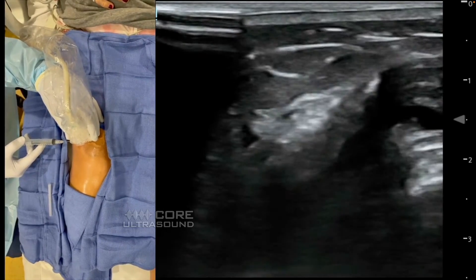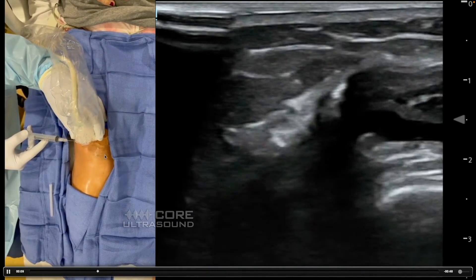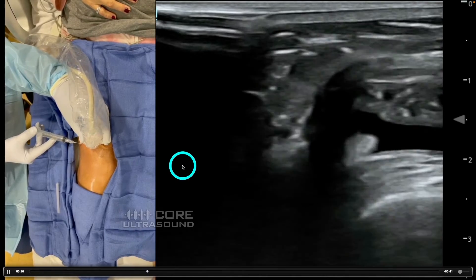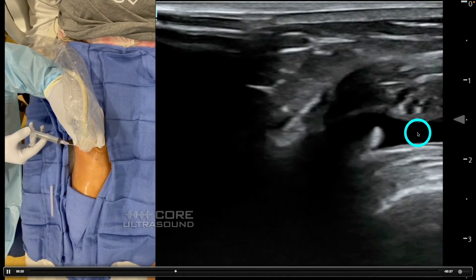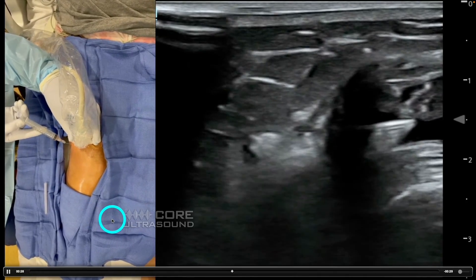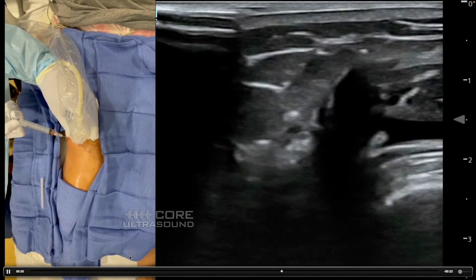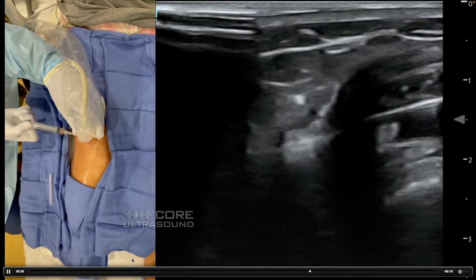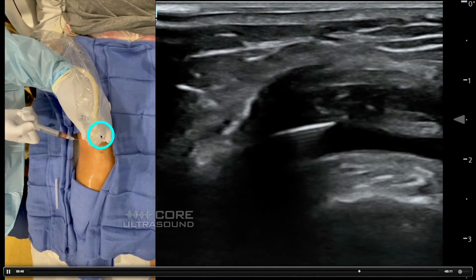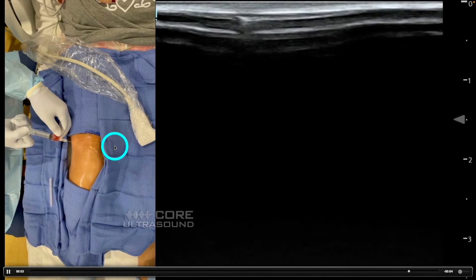Here is an example of performing this technique in the long axis of the transducer. I'm using a very small intradermal needle here, and you can see I went a little too inferiorly, so I'm having to angle it up a bit to get to that relatively small pocket. This is evaluation of a septic joint. Since recording this arthrocentesis, I've started using almost invariably spinal needles of at least 20 gauge so that you have a little more direction and it's a little easier to see where your needle is. As I reposition, I'm doing a lot of relocation of the transducer to keep a good view on that needle tip.